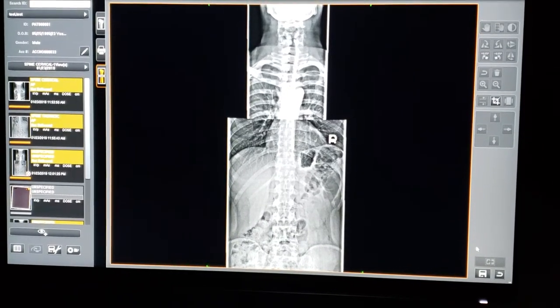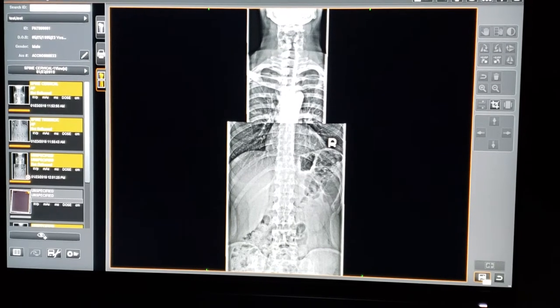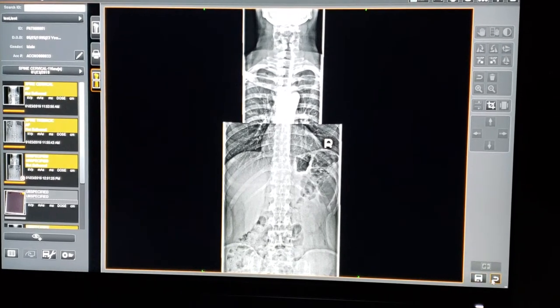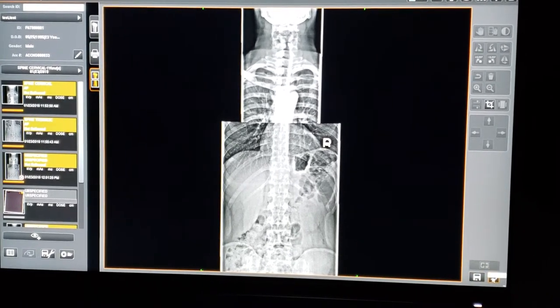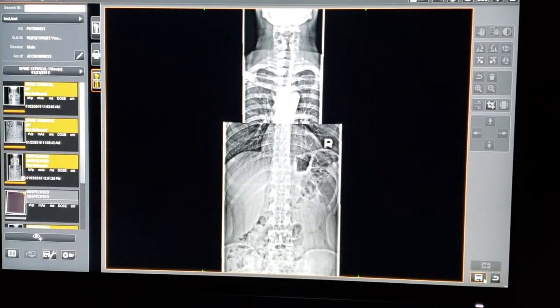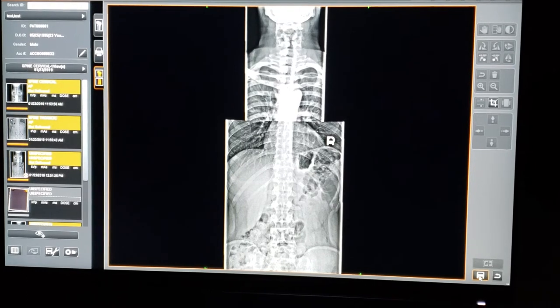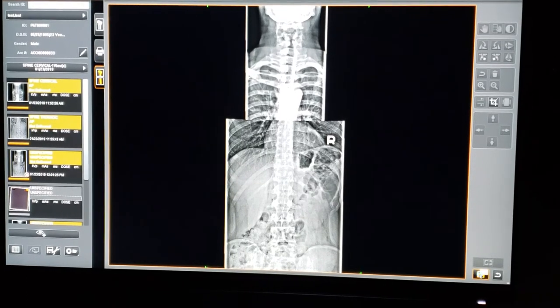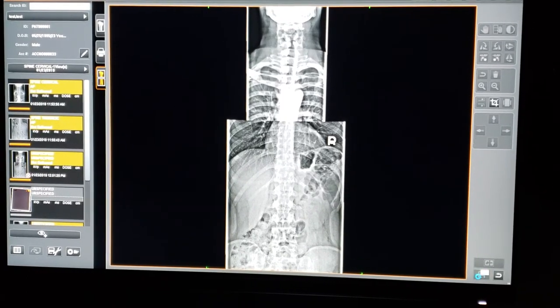If you're happy with that, you can hit the save button, or you can hit the reject button, undo it, and then you can start over again. I'm going to go ahead and hit the save button.